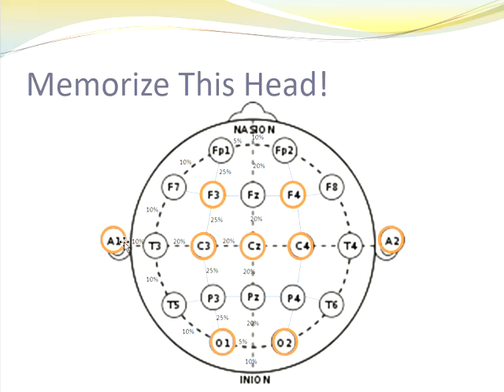And then don't forget, when we do the preauricular to preauricular, Nasion to Inion, we measured 10% up to make our first marks, 10% up from the anatomical landmarks. And so you've got to divide those remaining segments equally. All of these equal up to 100%. Same thing on this side. So you just got to kind of memorize the head.